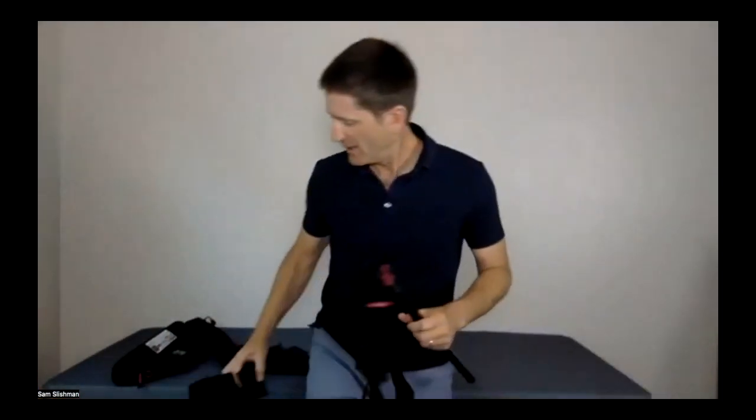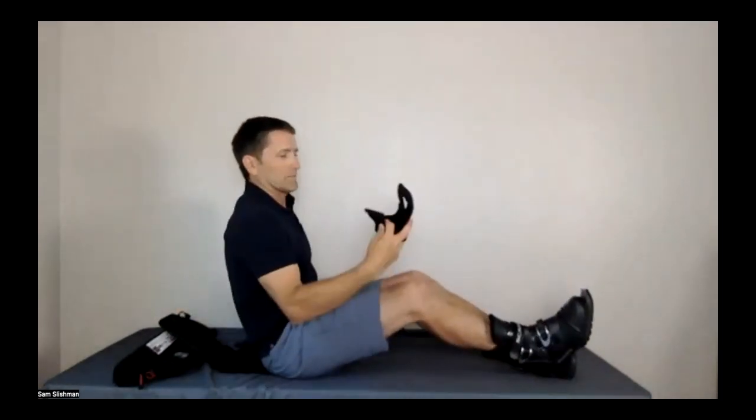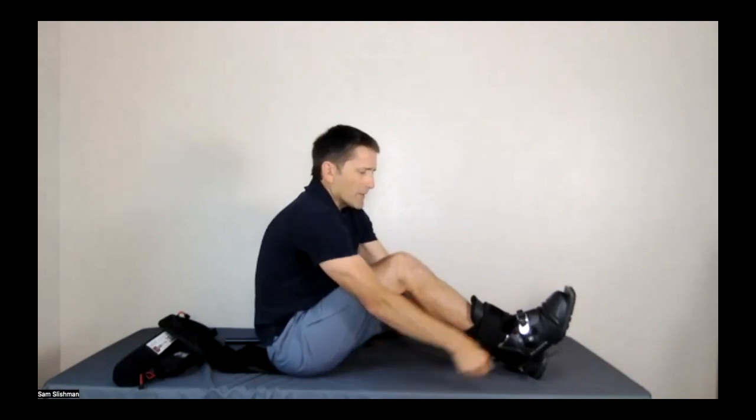I don't think many people ski in Singapore, but there are ski patrollers on this call. So I'm going to show you how this works on the ski boot. And there we go. And mind you, you can put this strap over a ski boot. You can also put it proximal to a ski boot. You can put it proximal to the cap. Put it over the ski boot. Have it locked right there, and I'm pointing the cap up. If I am putting it on the other leg, then the cap will point up in this direction.